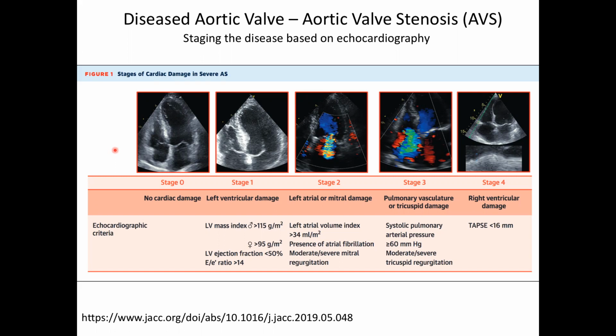So how do you quantify it? These guys came up with a mechanism by which they make measurements to get to these stages, right? And so if you look and you say there's no cardiac damage to the heart, the valve might have some regurgitant jets, right? But the heart seems to look normal otherwise. So it's just pumping away, right? So that's stage 0.